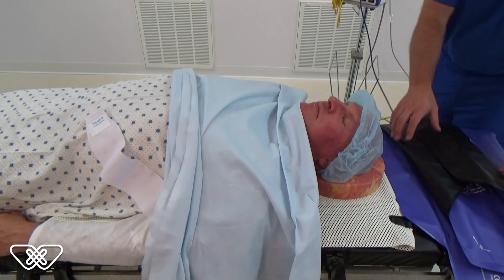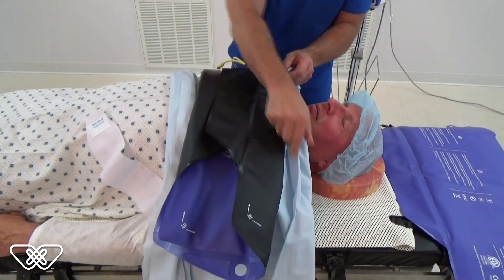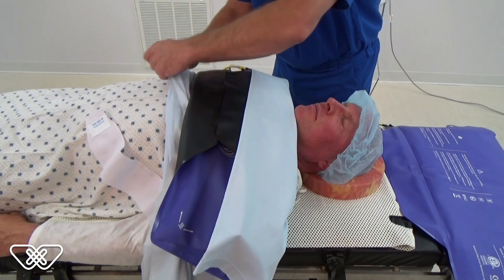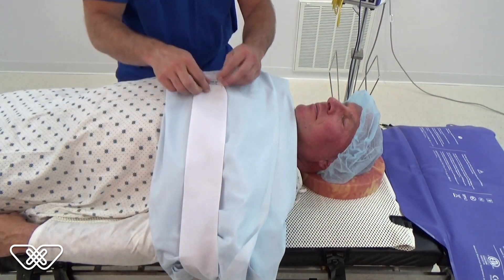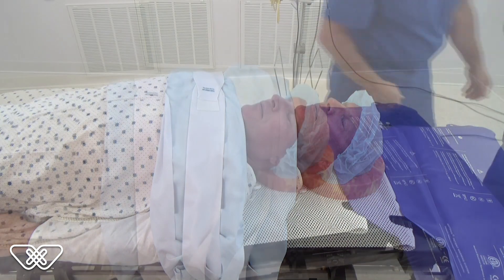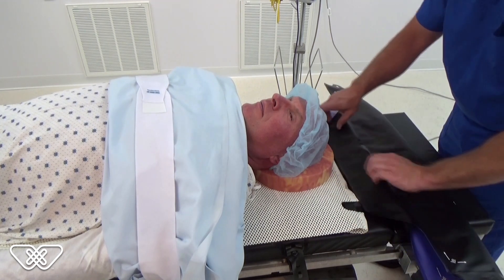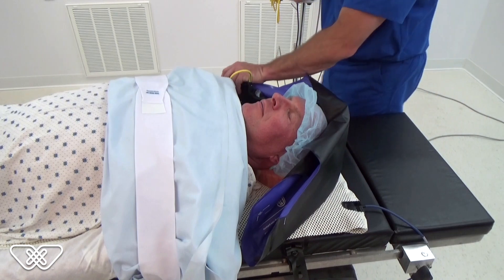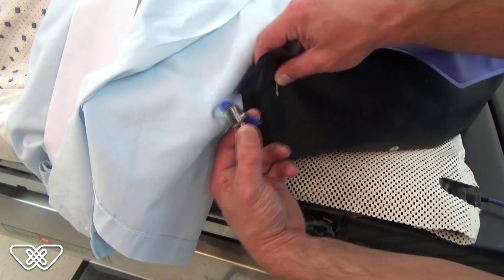Place a thin sheet over the patient where the blanket will go. Now place the control panel of a B105 blanket on the patient's upper torso. If necessary, fold it purple side to purple side while making sure that the sensor is still in contact with the patient. Any extra sheet should be placed on top of the blanket to ensure only a thin barrier is between the patient and the blanket. Then use the Velcro to join the two sections of the safety straps across the blanket to hold it in place. Fold the second panel of the multi-position blanket lengthwise so that the black side is facing towards the patient, and place it around the patient's head. Use the two clips from the kit to secure the edge of the panel to the secured panel on the patient's chest or the safety strap. There will still be access to the patient's face while providing warmth around the patient's head.